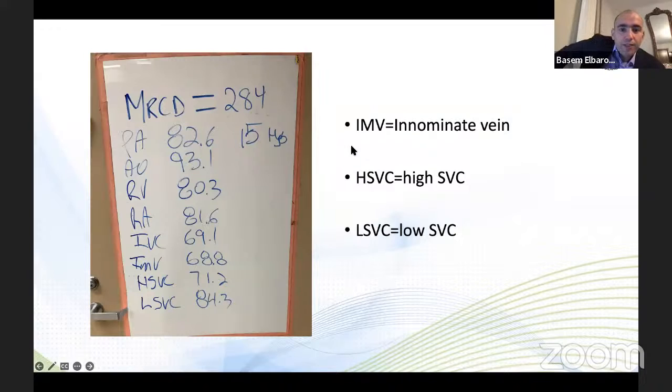Anomalous PV drainage, anomalous. So no, not sinus venosus. It is a very good thought, but sinus venosus is still within the right atrium, although it happens higher. This is a case of partial anomalous. So I think Dr. Bahir got it right. Anomalous PV drainage, and Dr. Larkley as well. So there is a partial anomalous pulmonary venous return.